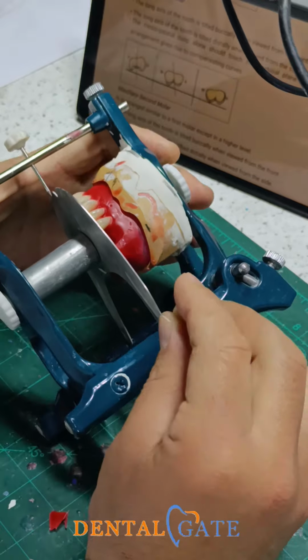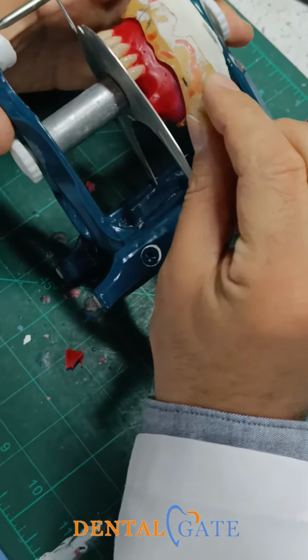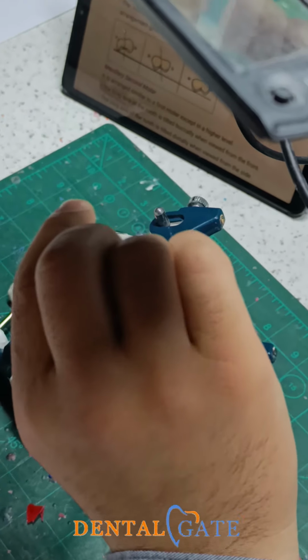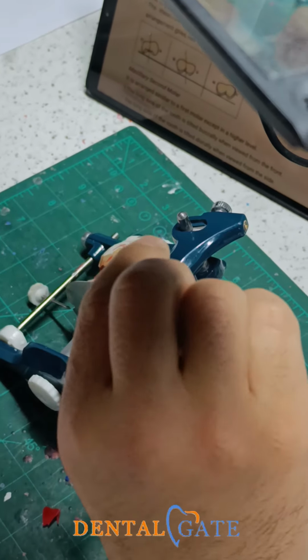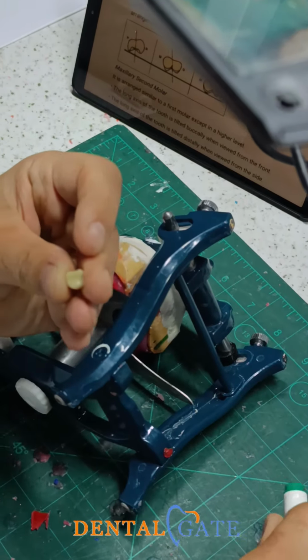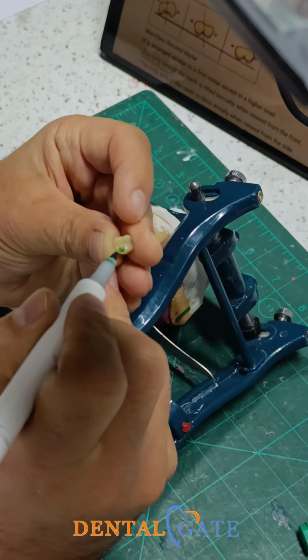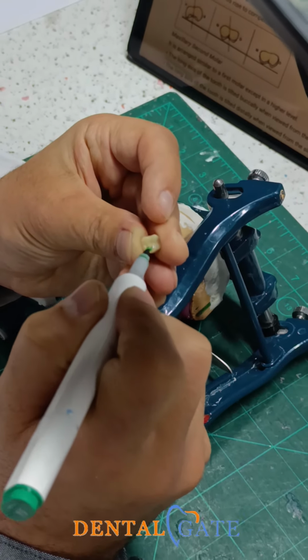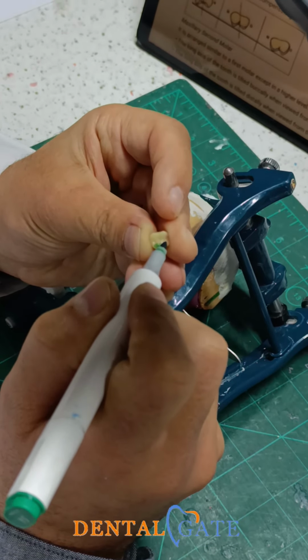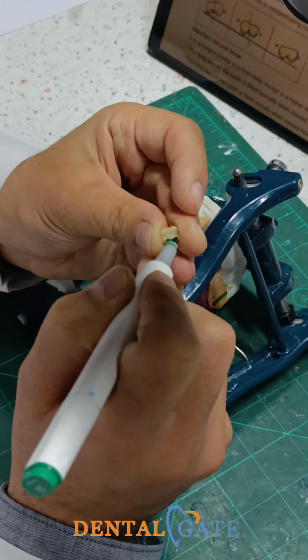So when you put it to your upper 6, tilt your two fingers. Okay, this is my plan. Now tilt your two fingers toward what? Toward the occlusal plane. Because I need only this cusp to be occluded, the functional one. The functional cusp should be occluded only. Yes, the functional cusp. Okay? Yes, the mesiolingual one, the biggest one. So only this cusp should touch the table.